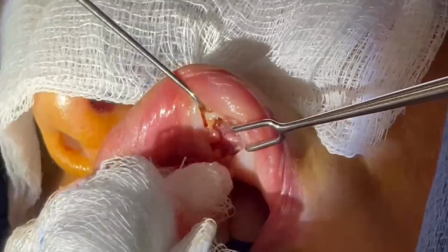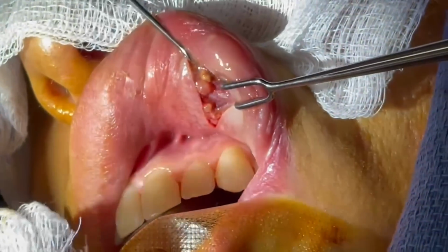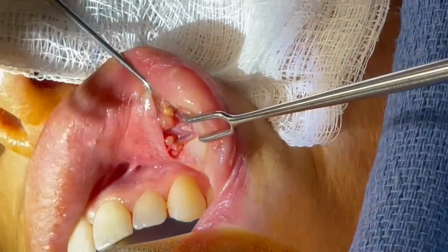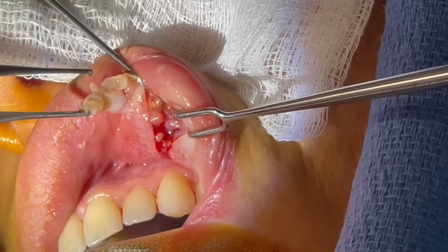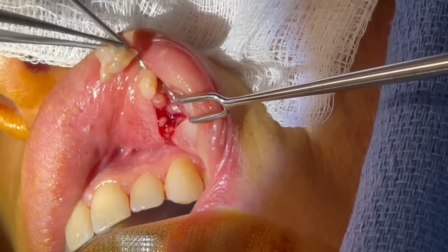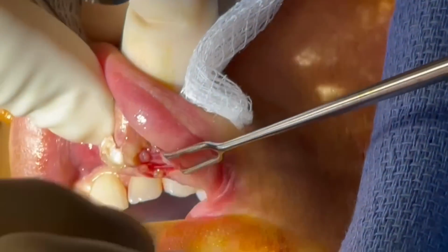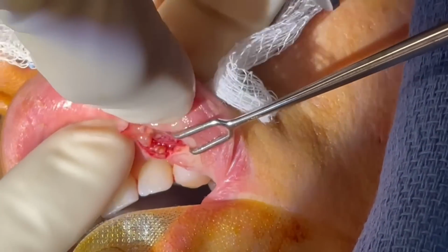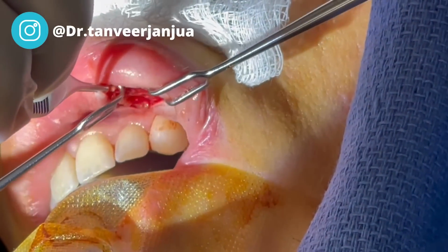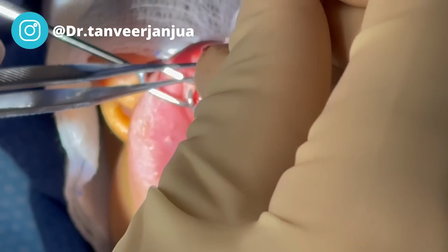Oh, wow. That's it. All of this junk right here. Oh, that's the side too that came on? Yeah, that's the side right here. No, this is just the secretions. Oh. And more. And more. Oh, wow. Oh, geez, even more. Okay. More cream cheese. And I'm going to take this as well. And right there.